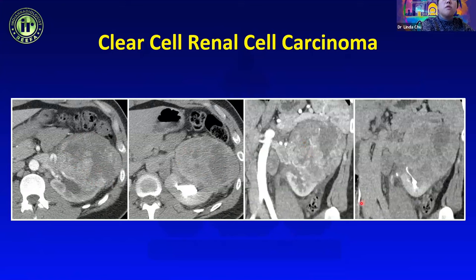In conclusion, renal masses are common incidental findings. We have ACR guidelines for the further evaluation of incidental renal masses based on size, attenuation, heterogeneity, enhancement, complexity, and growth to help us figure out what to do with these masses. Renal protocol CT or MRI are the modalities of choice for evaluation of indeterminate renal masses, and we can form a differential diagnosis based on specific imaging features and patient characteristics.